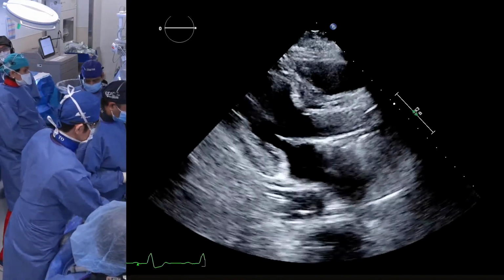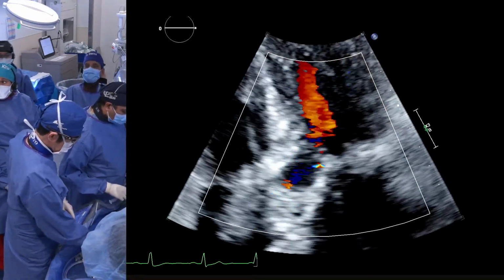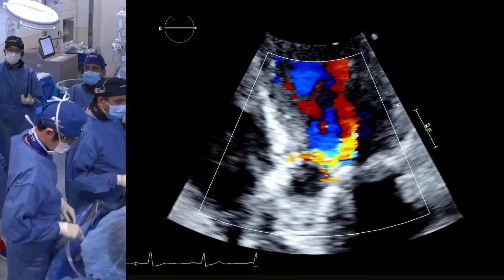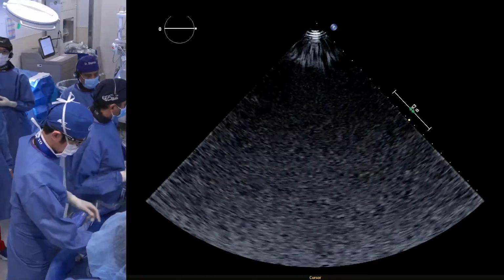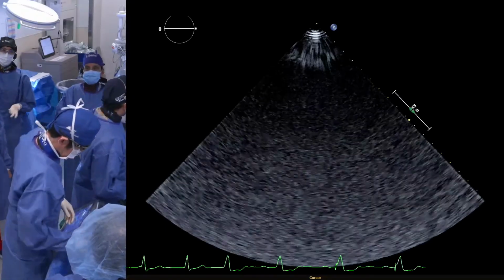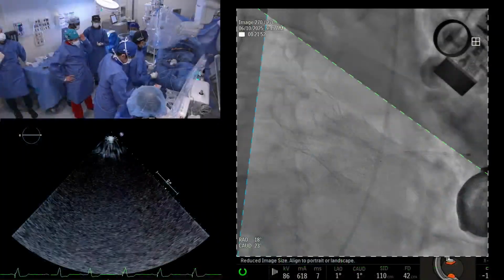So what we need to do is basically look and wait. And the only way, and we've done this in other cases as well, whether it's a tall valve or short valve, doesn't matter, is to post-dilate, and then if necessary, put a second valve in there to increase the radial force. So that's how we would manage these patients. But we don't do it acutely unless there's a hemodynamic concern or a stability concern, meaning that the valve is not stable at its current configuration.